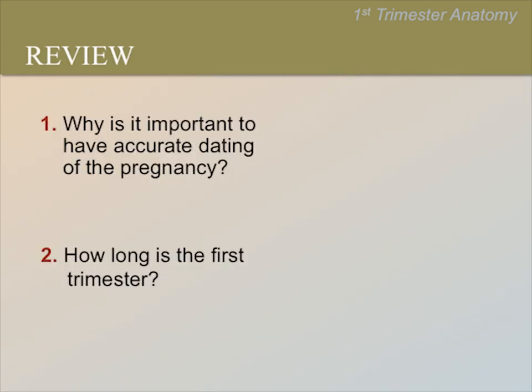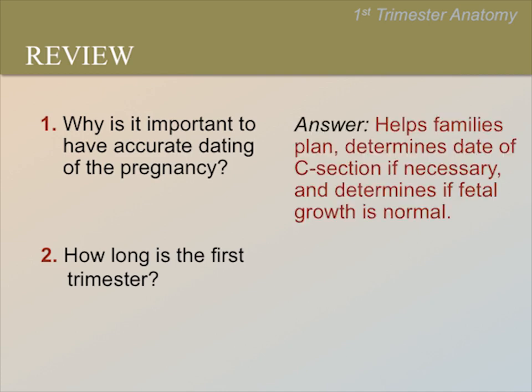Here are questions for review. Why is it important to have accurate dating of the pregnancy? The answer is that it helps families plan for the birth, helps healthcare workers determine the date of a C-section if necessary, and helps to measure fetal growth.